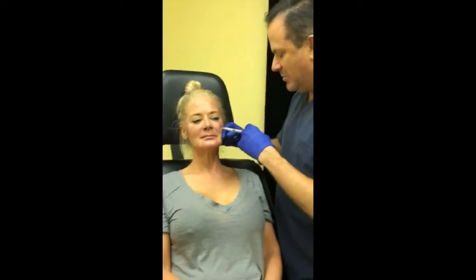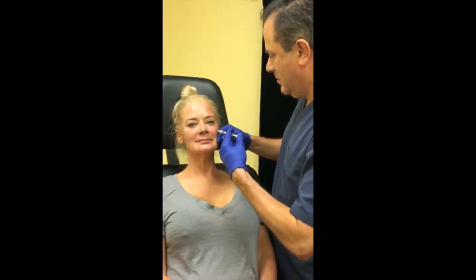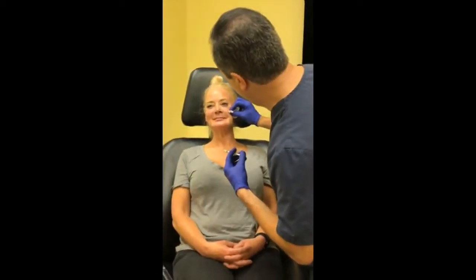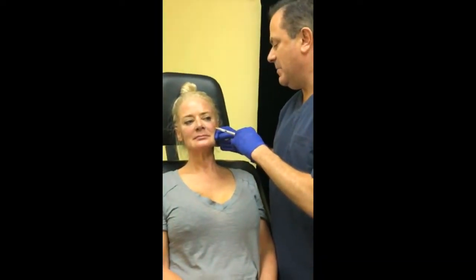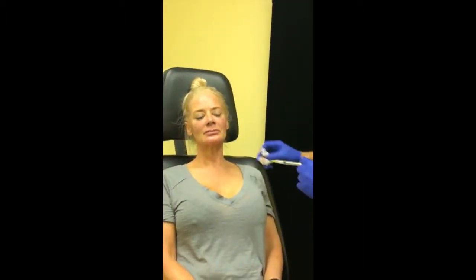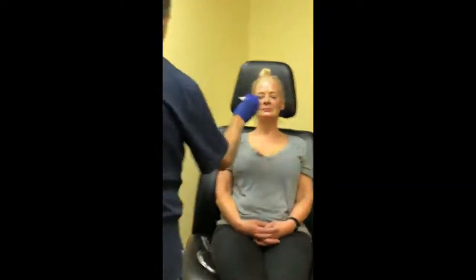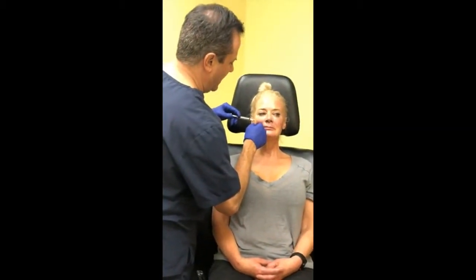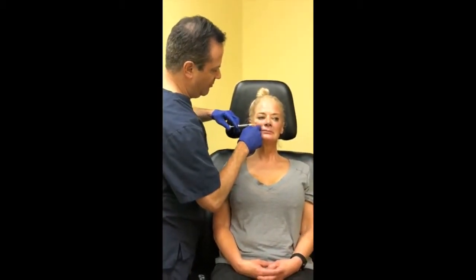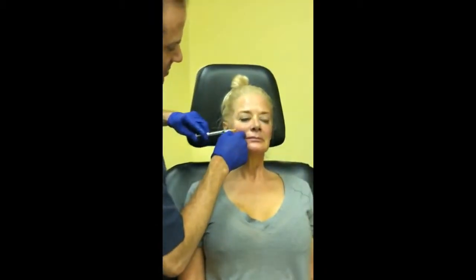I keep going back and forth to make sure we're balancing things. Does it work equally well on all areas of the face? Yes, I think it does — you just use a different injection technique in different areas depending on what you're trying to accomplish. Sometimes I'm laying in almost like a mound to build up an area, and sometimes I'm going underneath and fanning it out in multiple layers. Using the right technique, it tends to build up volume in a very natural way everywhere.